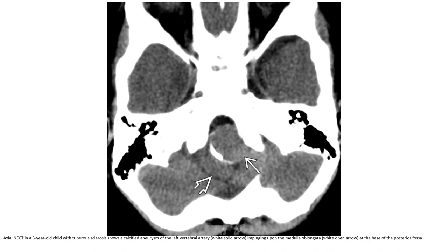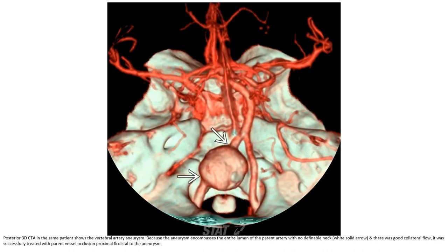Non-contrast enhanced CT in a 3-year-old child with tuberous sclerosis showed a calcified aneurysm of the left vertebral artery clinging to the base of the posterior fossa. CTA in the same patient showed the vertebral artery aneurysm compressing the entire lumen of the parent artery, with no definable length of the parent artery, but good collateral flow. The patient was successfully treated with parent vessel occlusion proximal and distal to the aneurysm.